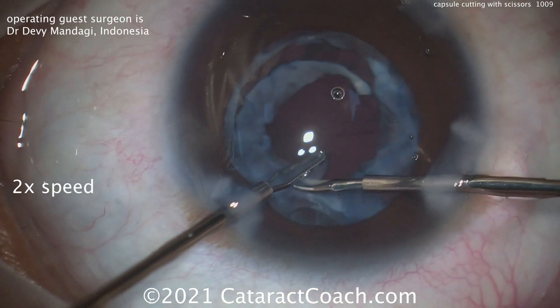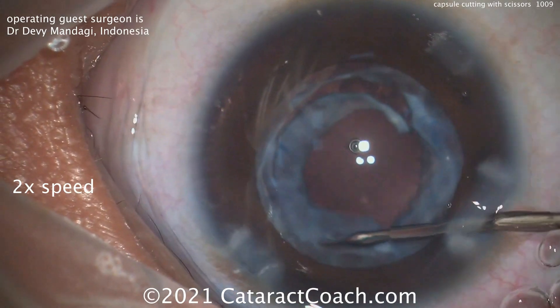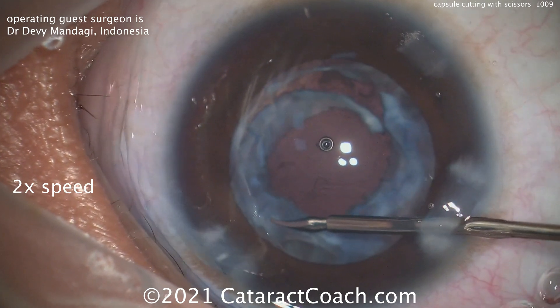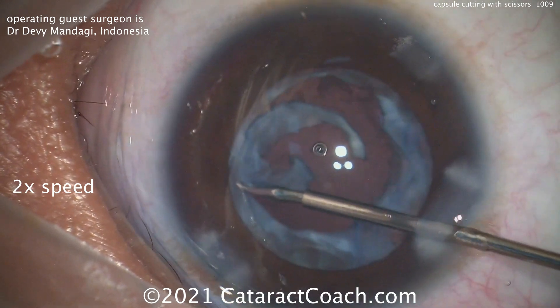Once this is enlarged to a sufficient degree, it'll also be a lot easier to place the IOL in the capsular bag. Make sure you keep the eye inflated with viscoelastic during this step. You don't want to inadvertently touch the posterior capsule with the forceps or the scissors, because you can damage it and poke right through.